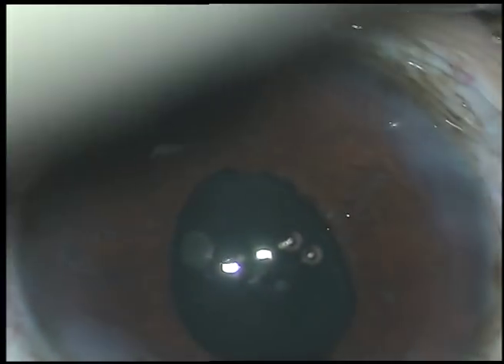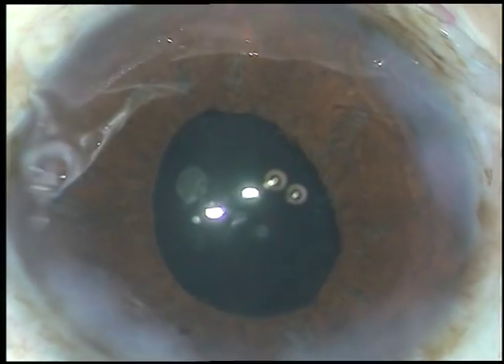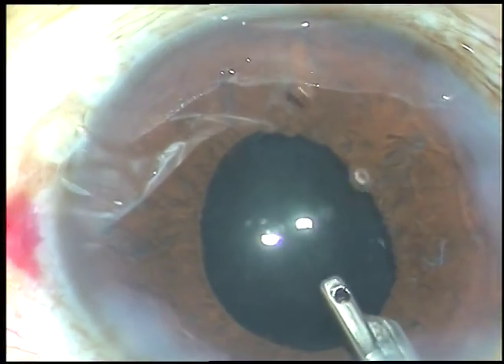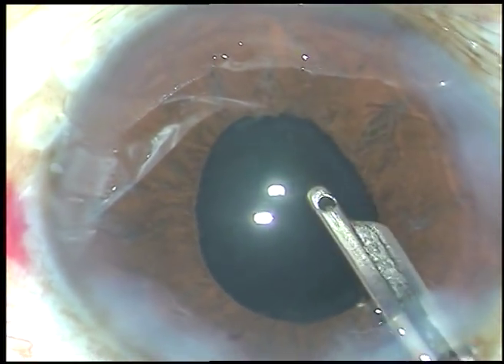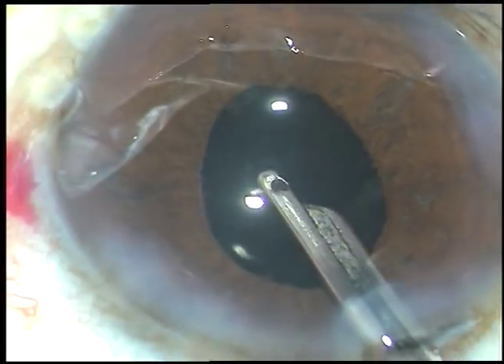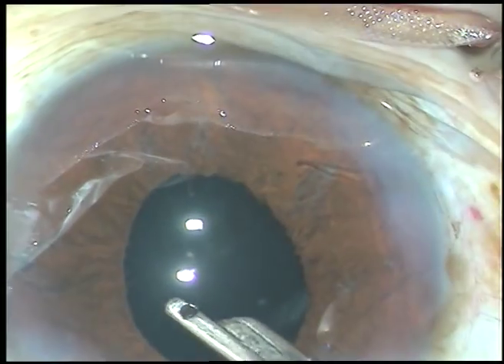Now hydrate the side ports and form the anterior chamber with BSS to conclude the case. Thank you very much for watching. Dear colleagues, please increase your skill and develop it to such an extent that you can take up all challenging cases. My wish is to develop and uplift you. Thank you very much.